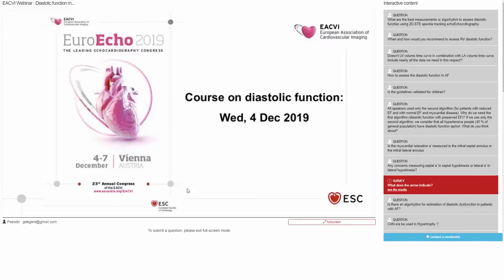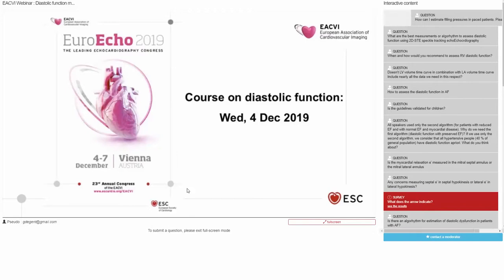Yeah. What about the LV global longitudinal strain? If LV GLS is down, does it support high filling pressure? If it's not conclusive by the guidelines, I don't think it can say high filling pressure. It probably says diastolic dysfunction, heart disease, probably. Yeah, exactly. I think that's a brief one.